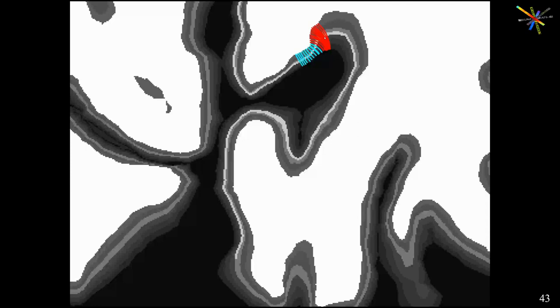What's happening here is that the cortical folding patterns are such that the cortex is mostly in plane here. That is, my cut is mostly perpendicular to the cortex, and so the cortex lies in the plane mostly. But as I go into the sulcus, in this direction towards the red traversals, the cut is becoming more oblique, and these planes have a tangential component to them. I've got to move my zoom windows around. The cortical layers here look much thicker than up here, but they're not. They're the same thickness. It's just because there's an oblique component to my cutting plane.